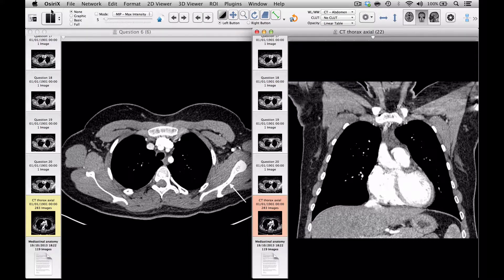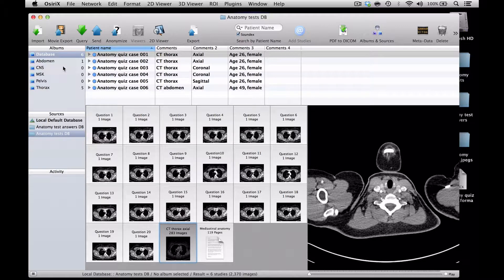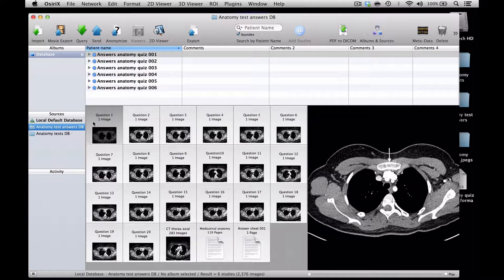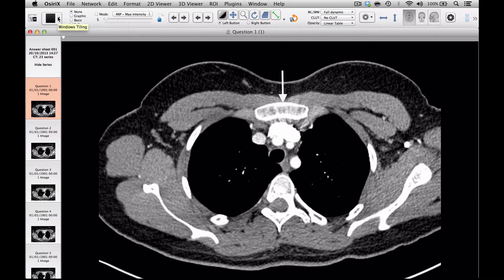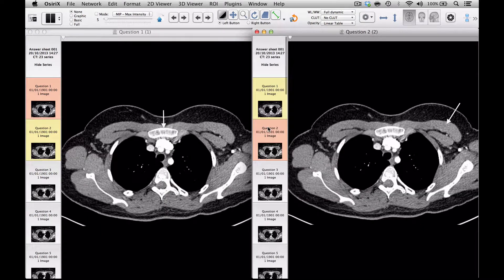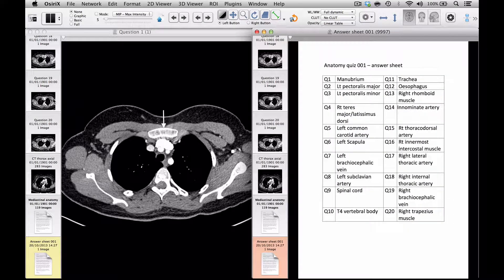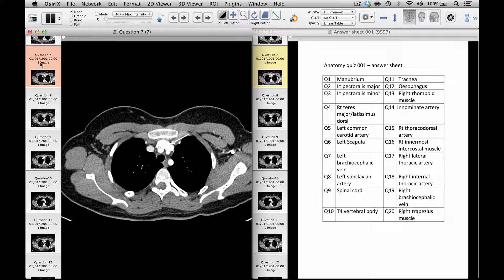So those are the question sets. If we look at the answer sets, these can be used either by the candidates when they want to go through the answers on their own, or possibly in a group tutorial scenario where they are being taught by a consultant radiologist. These sets, as well as containing the original images with the arrowed structures, will also contain an answer sheet. So if we look at case one, this can be looked at in conjunction with the answer sheet.